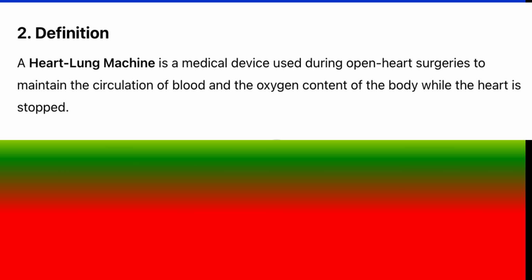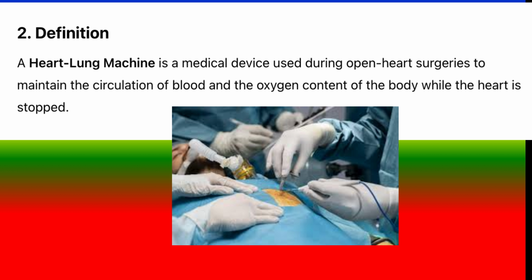2. Definition. A heart-lung machine is a medical device used during open heart surgeries to maintain the circulation of blood and the oxygen content of the body while the heart is stopped.